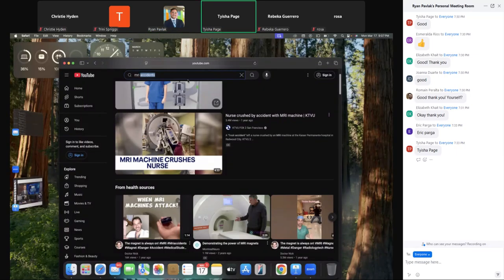We also have a unit that you stand in front of and it will tell you exactly where there may be metal. It's so sensitive, it will actually pick up a staple in a piece of paper, and it will tell you exactly where on the body that metal is.